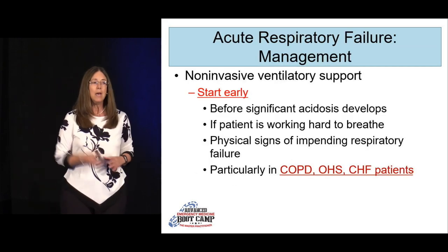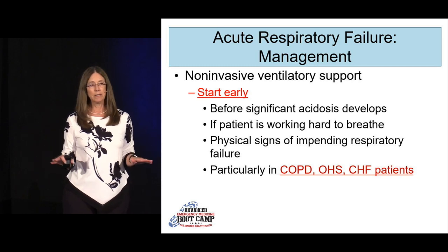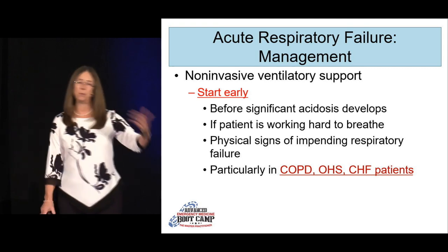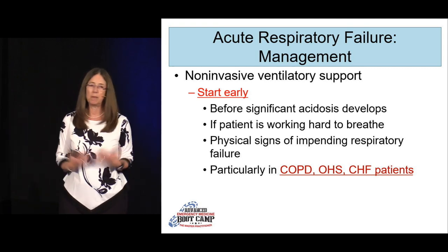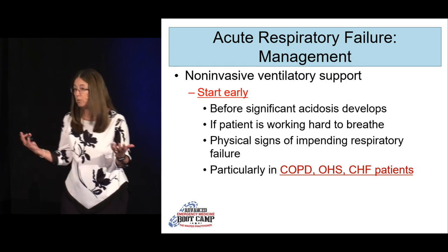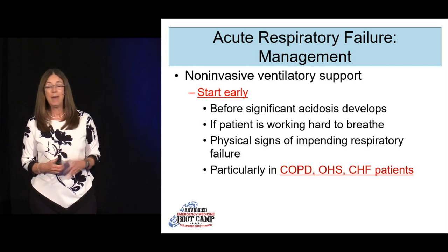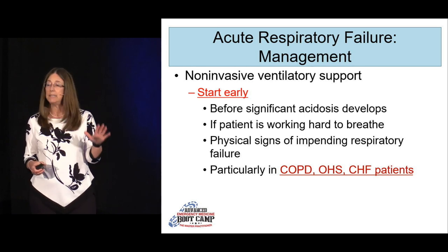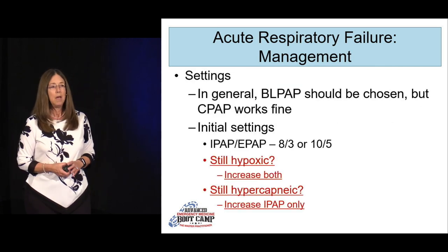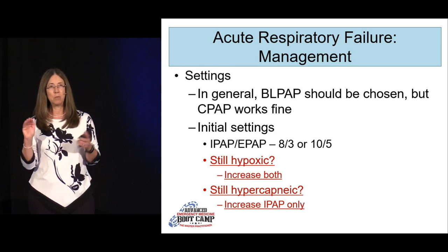The key to non-invasive ventilation, no matter what you're using it for, is to start early. If you wait too long, where the patient's basically tipped over, they have no respiratory reserve anymore, they're exhausted because their muscles just don't work anymore, they're too hypoxic, they're too hypercarbic, so they're too confused to actually cooperate to get this done. So what you want to do is intervene early. And in particular, there are certain entities, which we'll talk about in a second, that you should grab it early for on purpose. And as far as settings are concerned, don't memorize anything, okay?